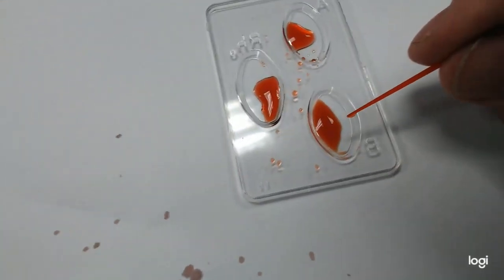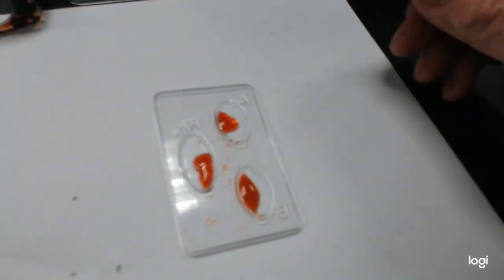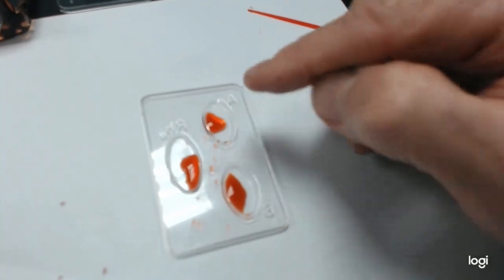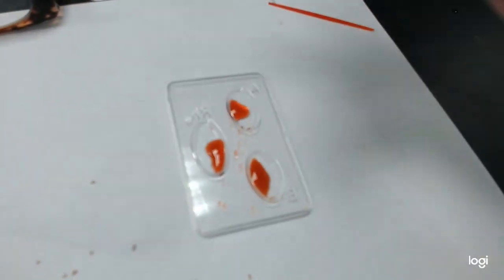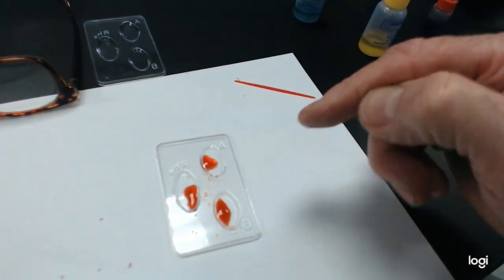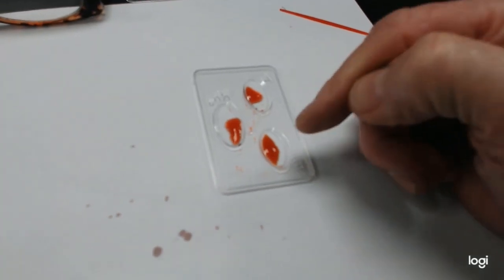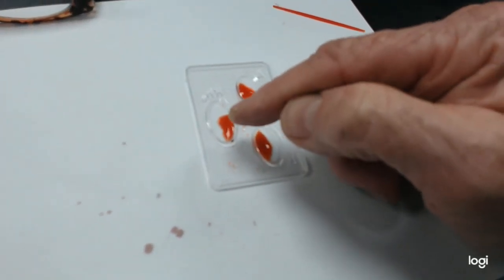Okay, so the A has not, but the B and the RH got thick. They clotted up. So what kind of blood would that be? That would be not A, but B, and it would be positive for RH. So this is B positive blood. Okay, it's that straightforward. You put the three in there, and if they clog up, that means that it has that particular factor on the cell. And so this would be B positive.